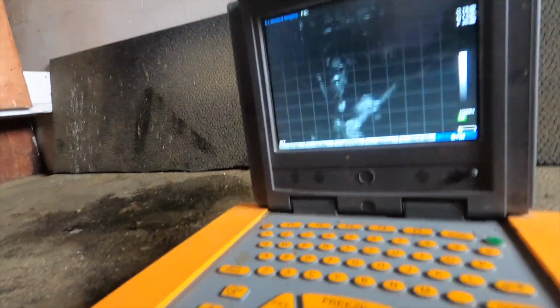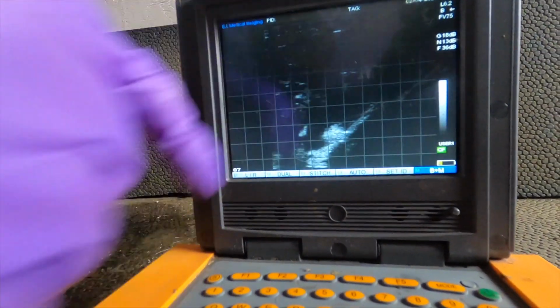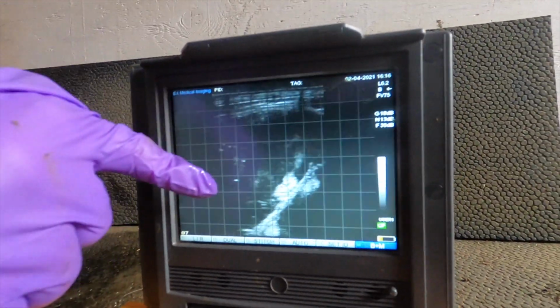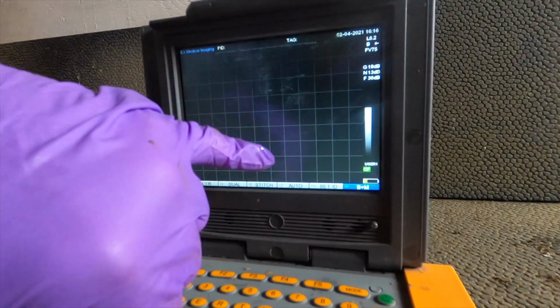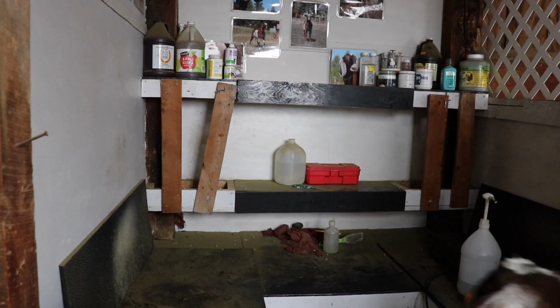Do you see that, bud? The rib cage there? Oh, there's a good picture. The heartbeat is right there. So I think you got one amniotic sac here. Okay. You have another one underneath here. Okay. So I think there's 2 in there for sure.